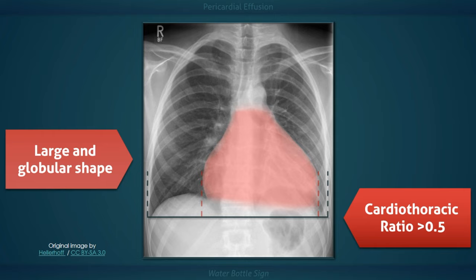On a side note, this value is not measured on an anterior-posterior radiograph because over-magnification of the heart would give an inaccurate estimation of its size. Inspection of the airway reveals that the lower trachea is not quite vertical and the carina appears displaced to the right. This can occur if the x-ray was performed while the patient was rotated to the right, or because encroachment of the engorged pericardial sac on the lower airway can push the carina away from the midline.